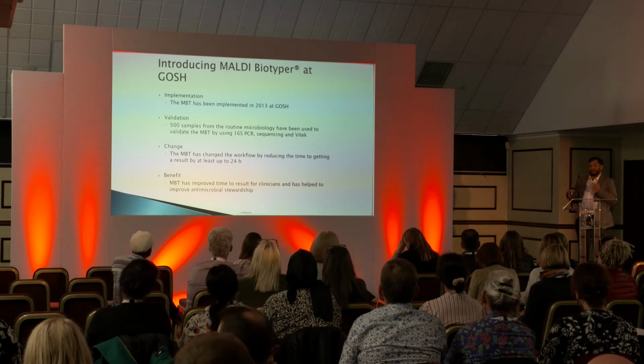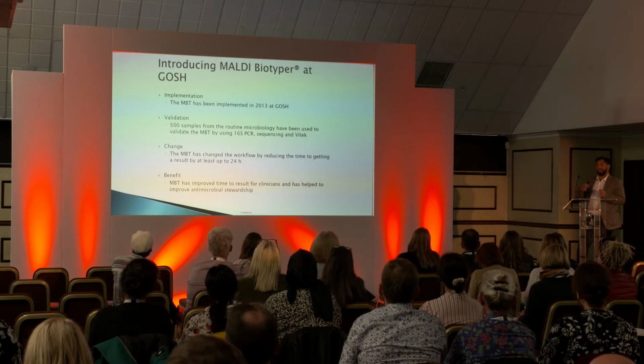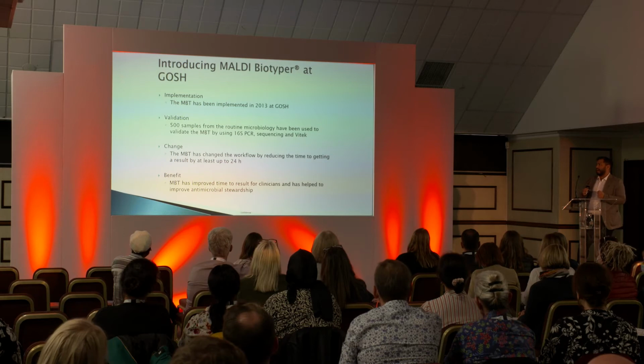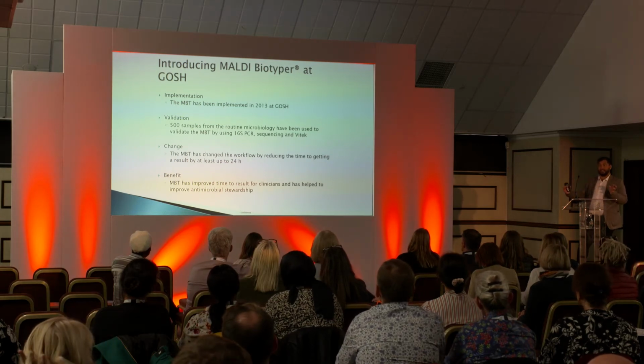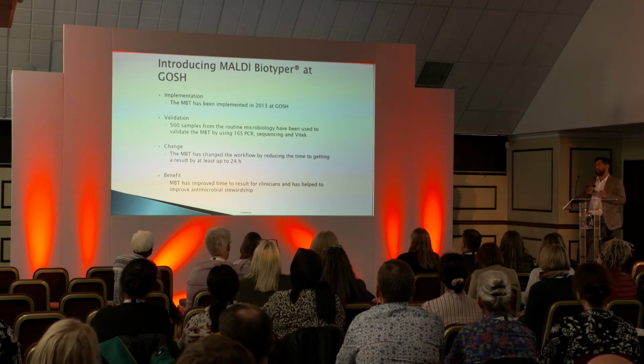Maldi is brilliant, but there can be little bits that you need to check you're getting the right ID, and that's why we need to be sure, before we're putting out patient results, that it's doing what it says on the tin. We confirm these with control organisms, so this is bacteria which are known strains or ones that we've confirmed by molecular techniques in the laboratory.